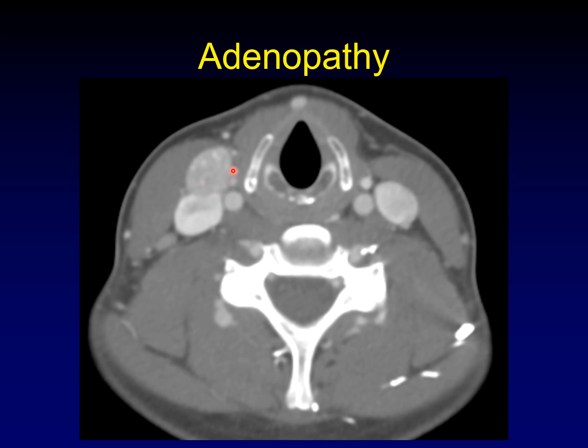Sometimes metastatic nodes are not cystic. Here's a metastatic node where you can see those fine speckled calcifications we were discussing within the primary tumor — sometimes they'll appear within the nodes as well.